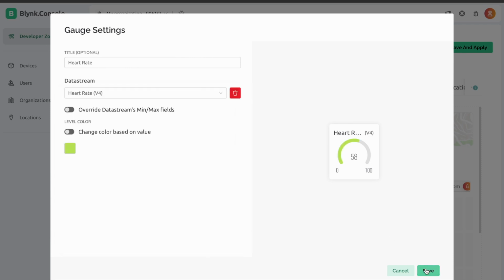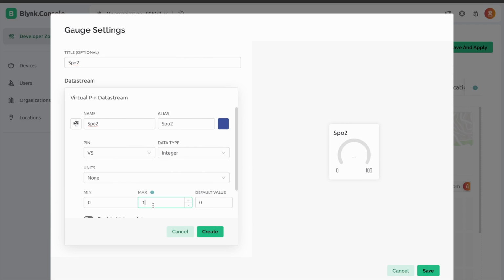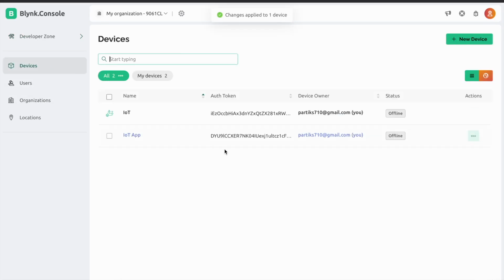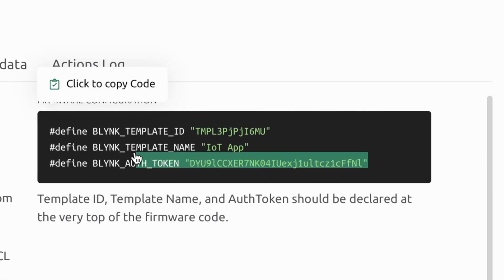Now go to the second gauge and edit the name to SpO2. Go to data stream, choose virtual pin and I put the maximum value as 100. If you want, you can choose 200 also. Now save it, go to the device, save and apply it, and go to the IoT app and the device information. Just copy this ID and paste it in your code.